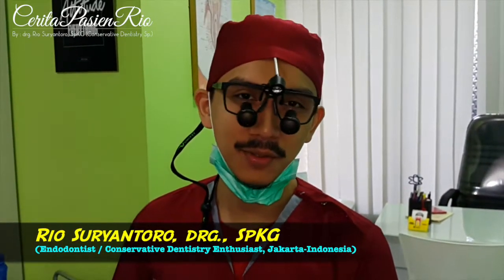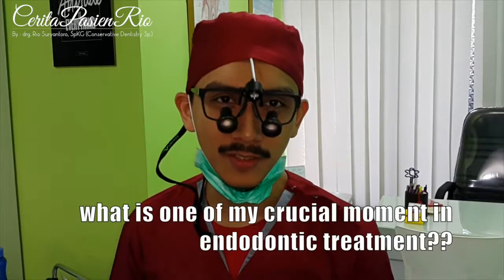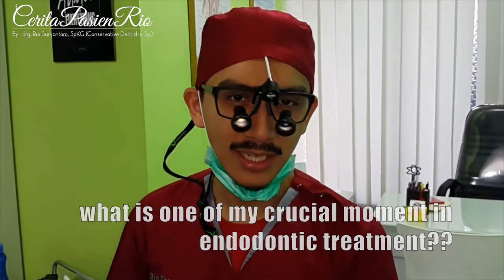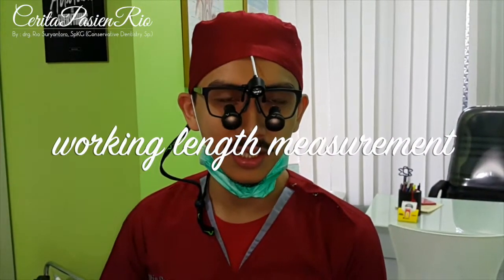Hi, good morning. My name is Viyo. I am a endodontist from Jakarta. And what is my crucial moment in the endodontic treatment? The working length measurement. And today we are going to do this: how to measure the working length through the apex locator.